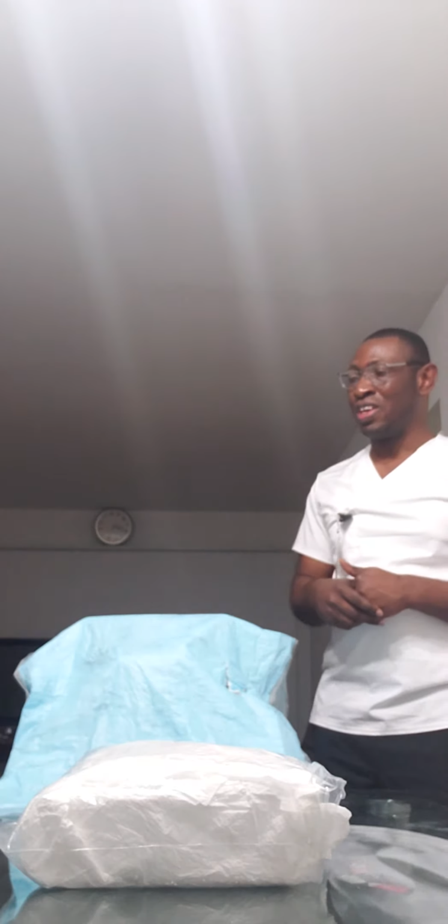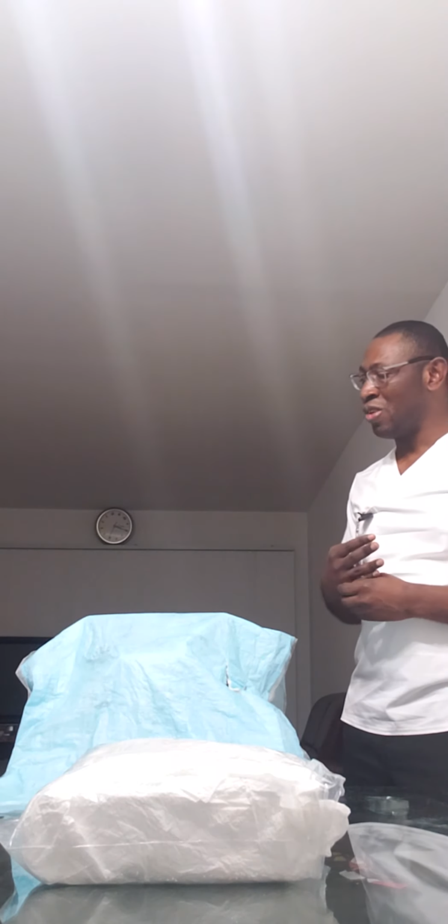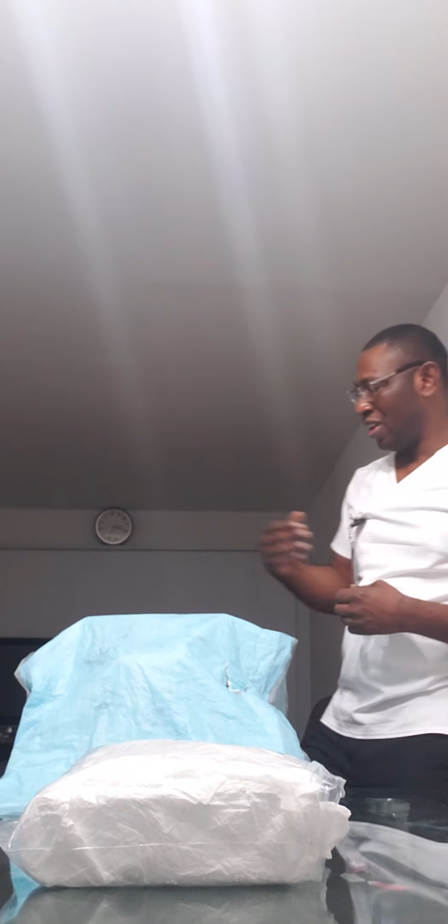And basically, you have a physician's order for Foley insertion, okay? And before we go ahead, can you help me confirm your name and date of birth? Okay. And can I see your armband?